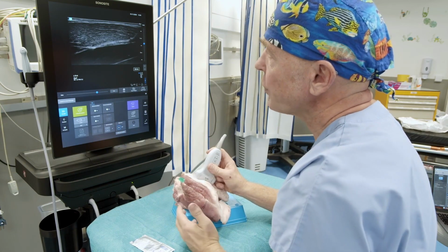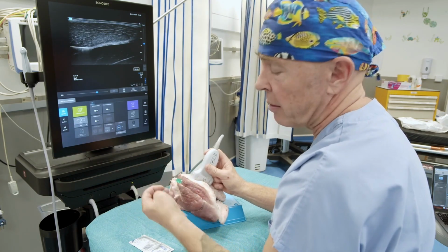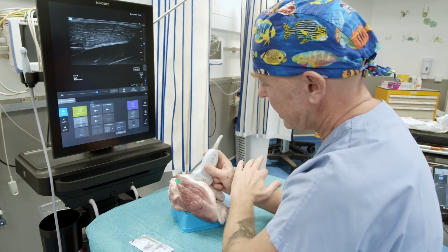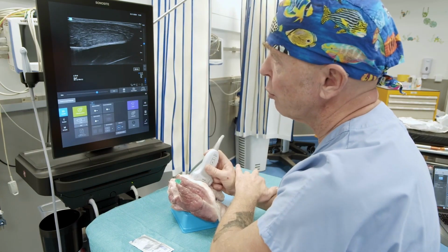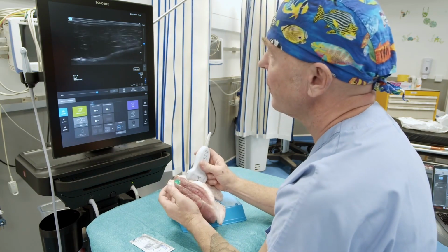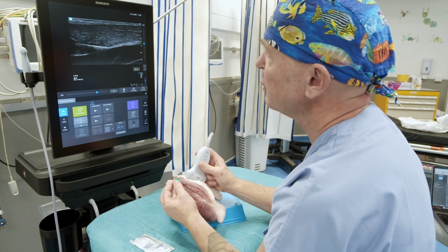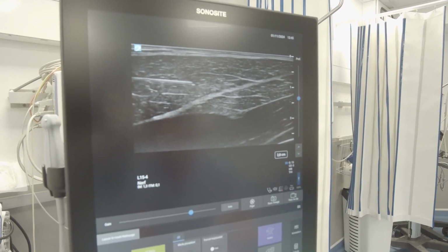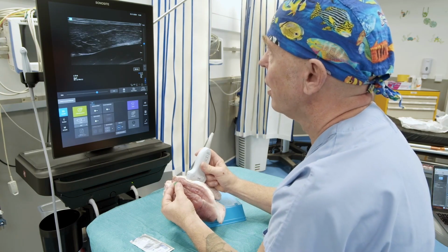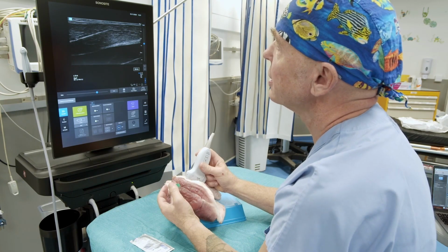And also keep in mind that as long as you are not injecting, the needle is in place and you are not at risk. You don't need to aspirate since you are not injecting. So you can absolutely let go of your hand, relax a little, and keep that hand steady and well positioned. Concretely, that's what I would do on a patient by placing my wrist to stabilize the image. And subsequently, there you proceed, resuming the visualization of your needle, and then you have the ability to adjust your orientation accordingly. We can envision that we had an air slightly elevated, and then there you proceed, that was it, there you proceed. So what is important similarly, you see I put myself in a little bit of difficulty with the angulation. Well, here, this was my target.